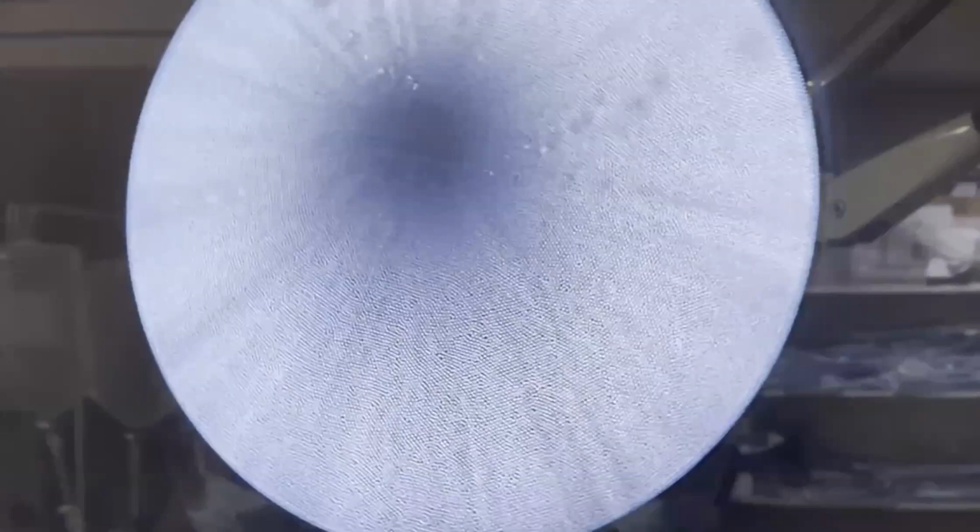If we have targeted the lower calyx, I mean the posterior calyces, then because of gravity, the fragments are going to easily fall out of the system. We did not pick up these fragments. In case needed, we can even pick up those fragments with the help of forceps or a basket. Once all the fragments have been removed, we place a guide wire so that a DJ stent can be inserted. All these things are done under fluoroscopic guidance. After placing the guide wire, the DJ stent is slid over the guide wire.